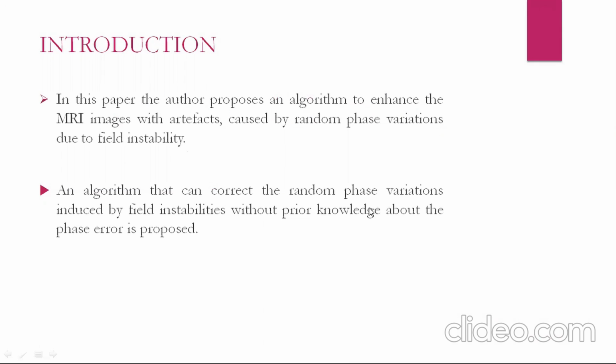Introduction. In this paper, the author proposes an algorithm to enhance the MRI image with artifacts caused by random phase variations due to field instability. This is an algorithm that can correct the random phase variations induced by field instabilities without prior knowledge about the phase error.